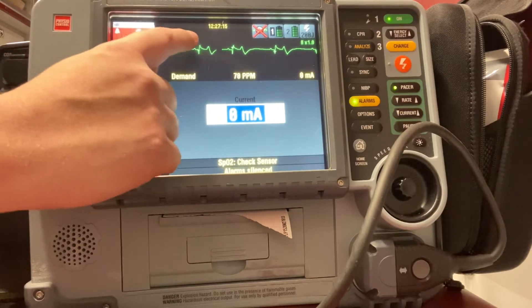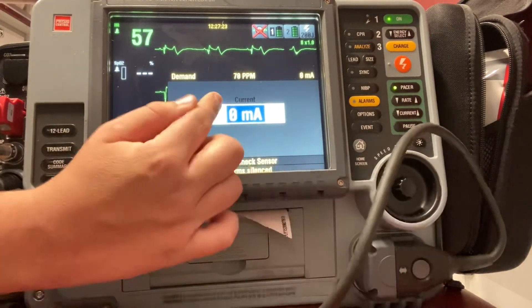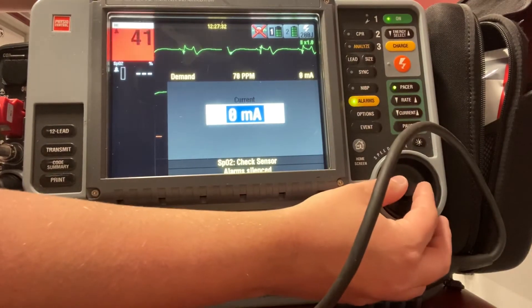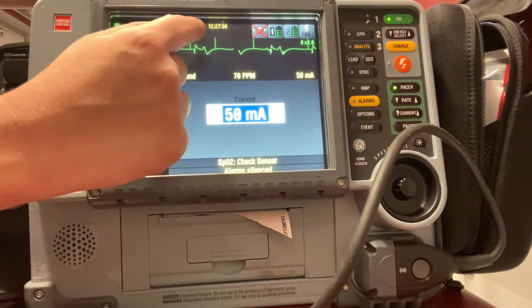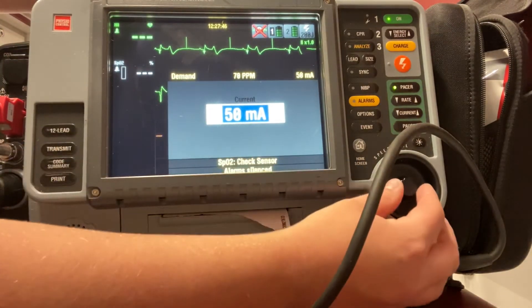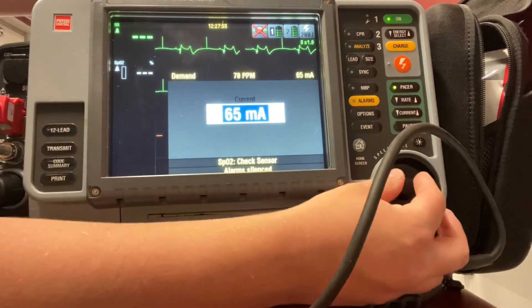You can see I start getting some arrows up there — it's going to try to start pacing, and what it's doing is trying to capture that electrical impulse that the heart already has. It automatically prompts me to go to milliamps. If it didn't, I could just move down from rate to current and hit current on my monitor and it'll bring me back to the same spot. I'm going to go ahead and increase my milliamps, and you can see I'm starting to get some pacer spikes. What I want is for those pacer spikes to line up with the QRS complex, so I'll slowly go up until I get capture — meaning those pacer spikes are going to match up with my QRS complex.